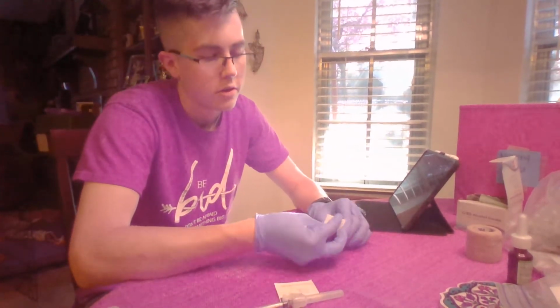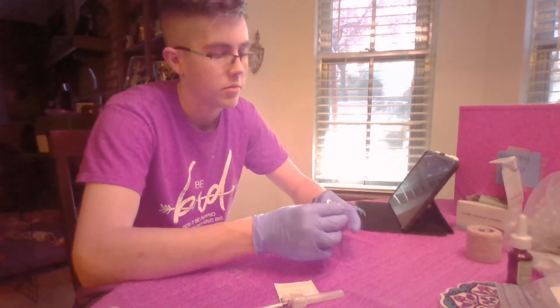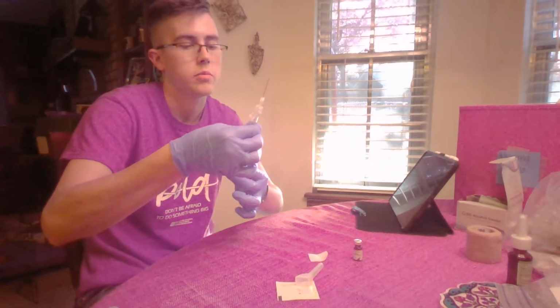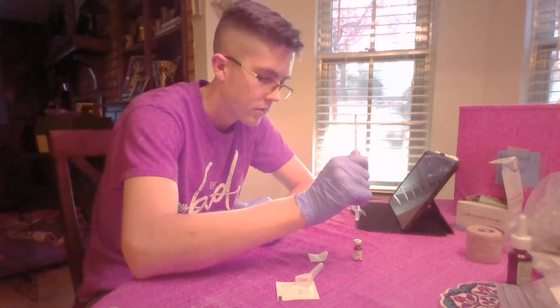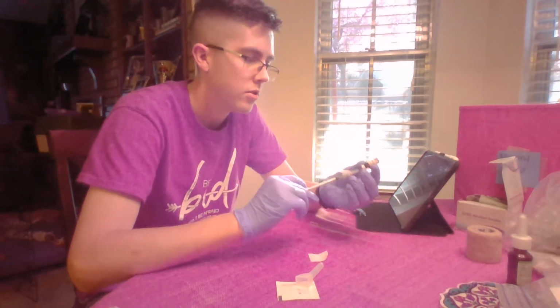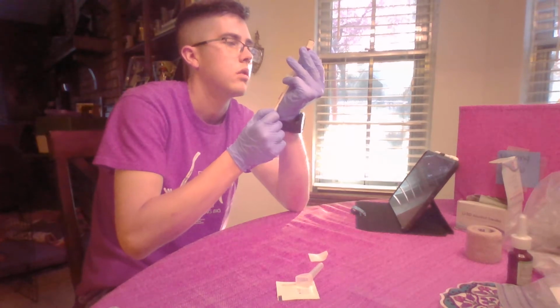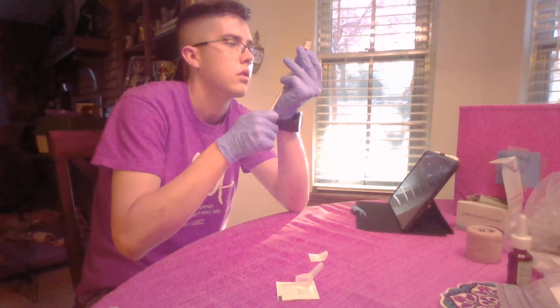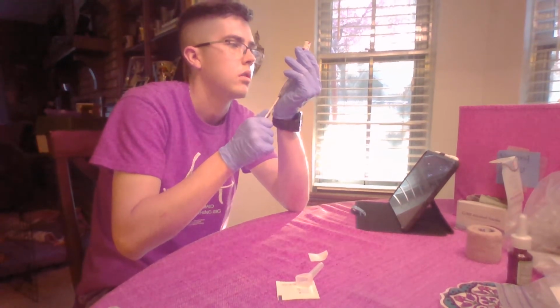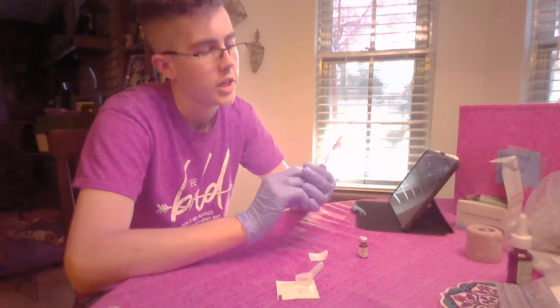Go back, re-clean the top of your vial, check to make sure that this is the right medication, grab your needle, pull back 1 milliliter of air, inject that into your vial, pull that out of your vial, remove any air pockets.